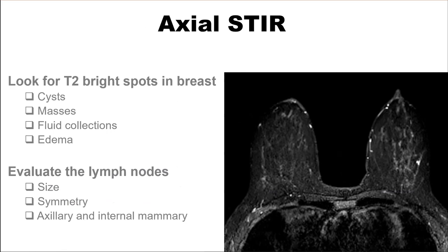On the axial STIR, you're looking for any T2-bright spots. These could be cysts, masses, fluid collections, or edema. Also, the T2-weighted or STIR images are very good for evaluating lymph nodes. Look at the size and symmetry — look in the axilla, but also in the internal mammary region.